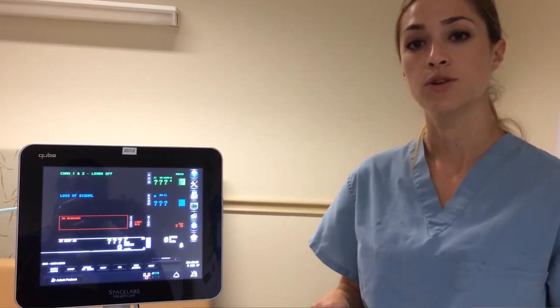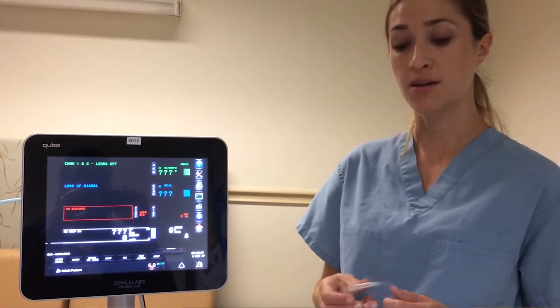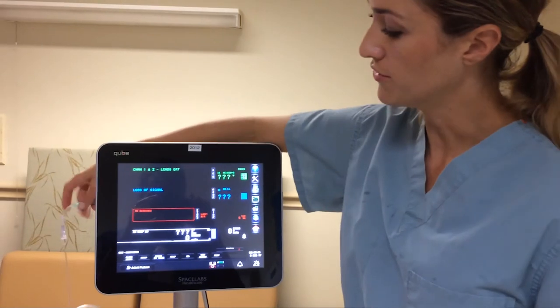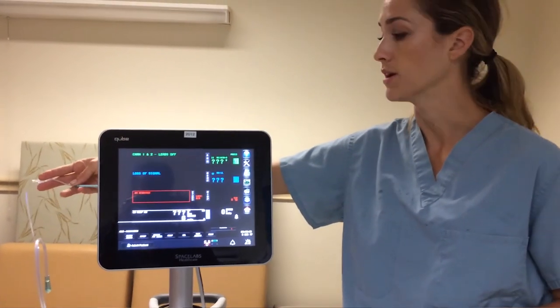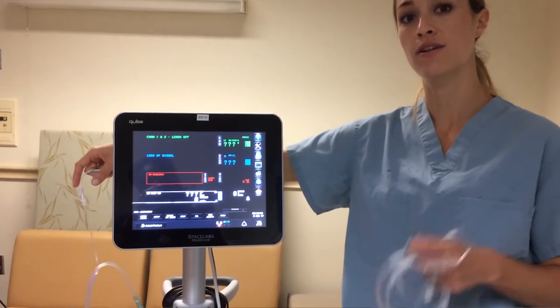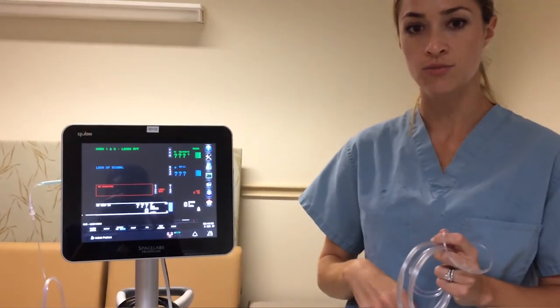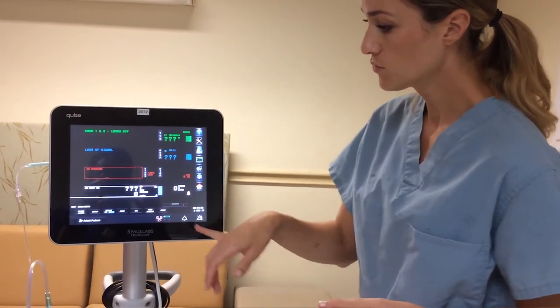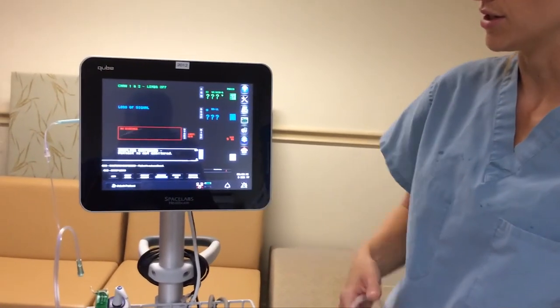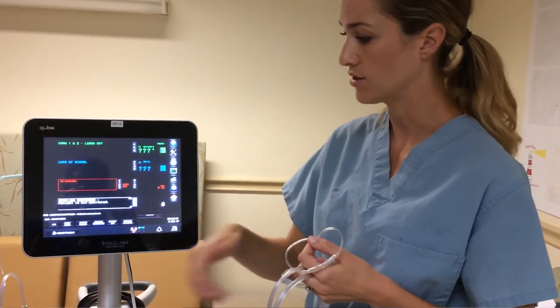If you are doing a breathing treatment, you do not want to have the capnopod actively sampling during it. First, it will gunk up the line and the filter, ruining a reusable filter that can last a very long time if treated well. Second, it will skew your trend and give you inaccurate numerics. You can take the nasal cannula off your patient and acknowledge the alarm when it stops detecting breath. Alternatively, if you don't want to remove the cannula, go into the setup menu and suspend CO2 while doing the breathing treatment. Once you're done, resume CO2.